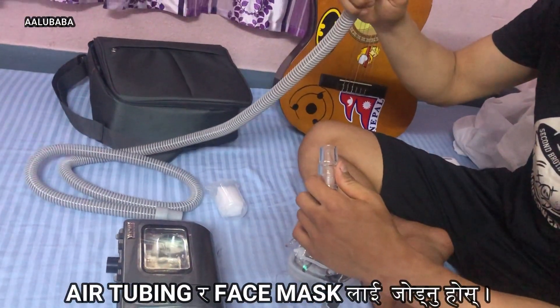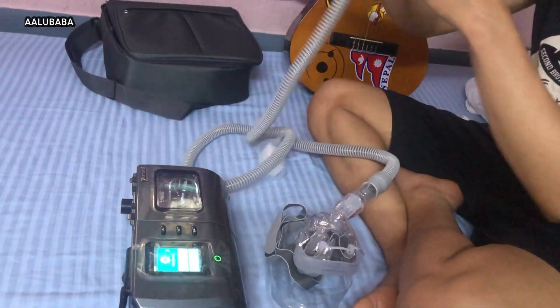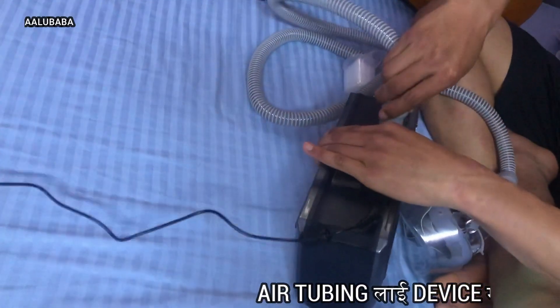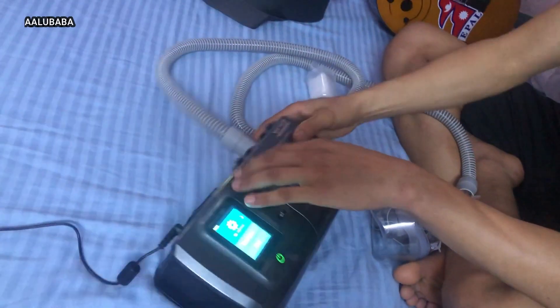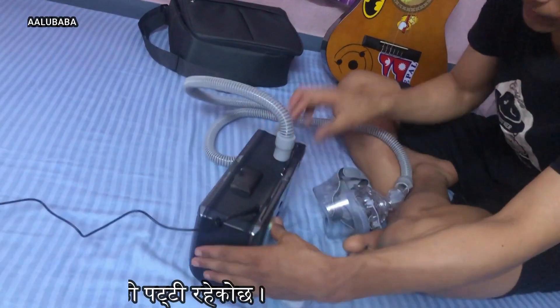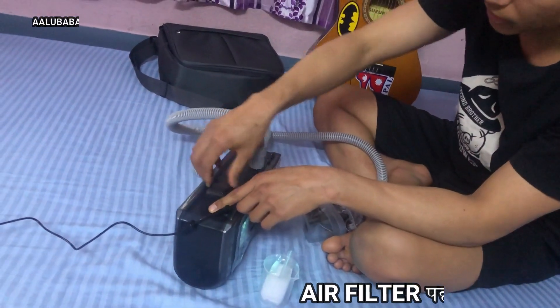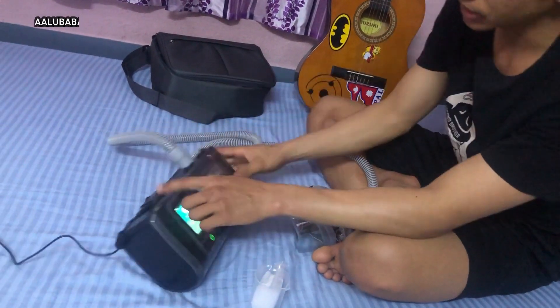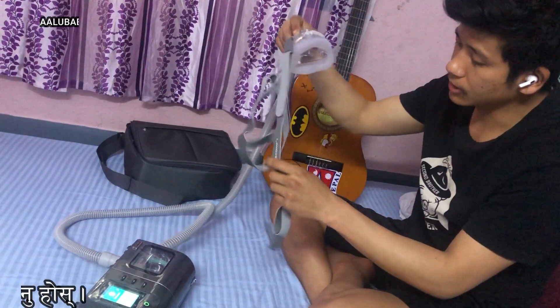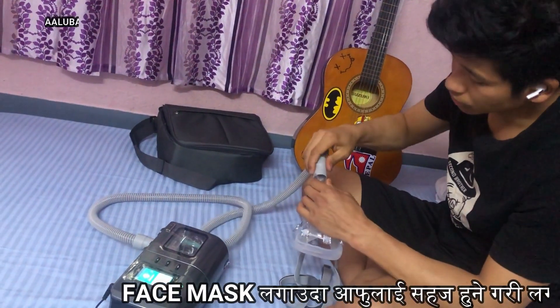You can check the pipe to make sure there is no air leak, and then you can see how the machine will be able to work. If we can detect an air leak, we can then check the air filter — we can remove the air filter. We can also use the face mask and make sure the face mask fits properly.